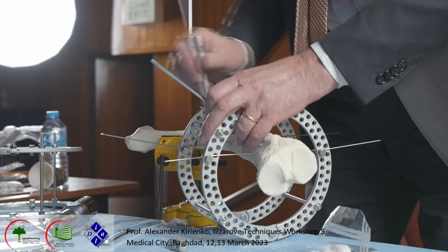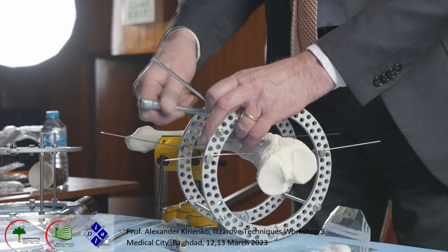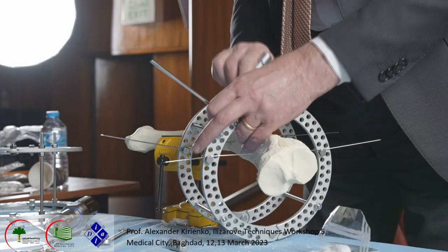Okay, after that we may stabilize it better later. For now it is enough.